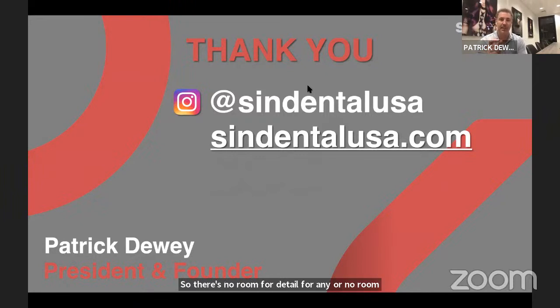So the multi-unit scan bodies, it's a precise screw channel where the screw goes inside. So there's no wiggle room. It's just perfect and passive. So it's not loose enough for a 1.6, is my point. But yeah, stay in touch with us. We will keep you posted. We will have a market release once those scan bodies are out for the 1.6.